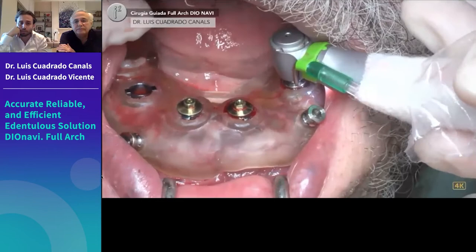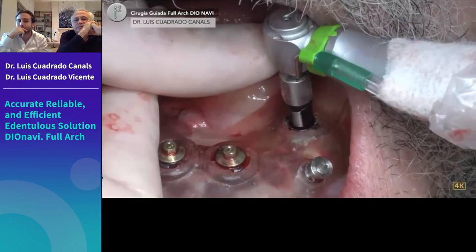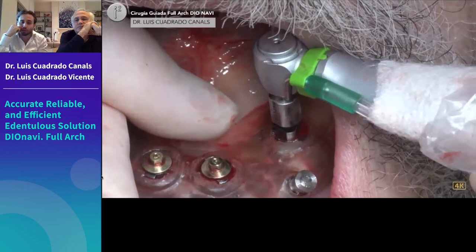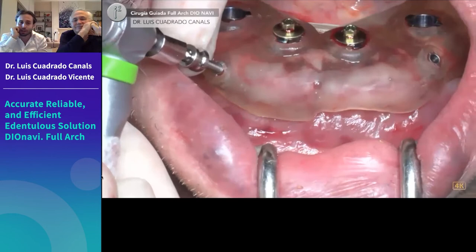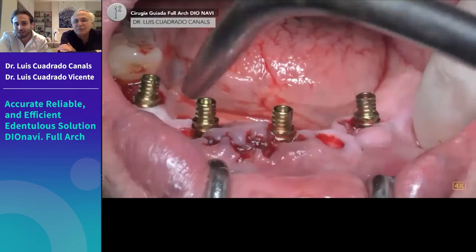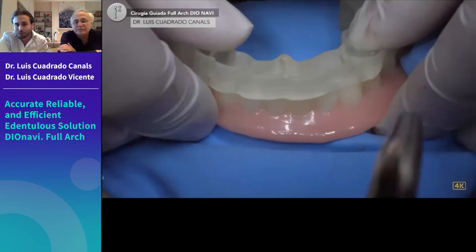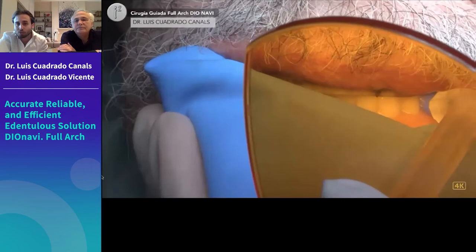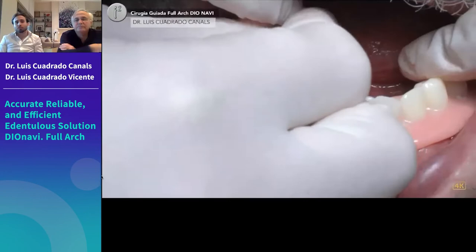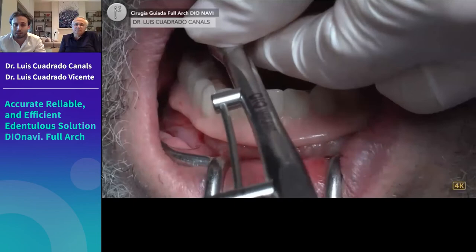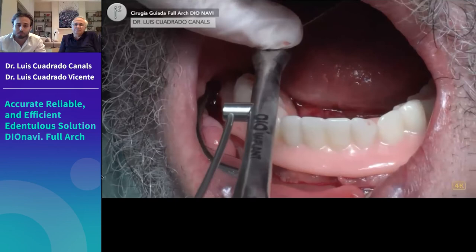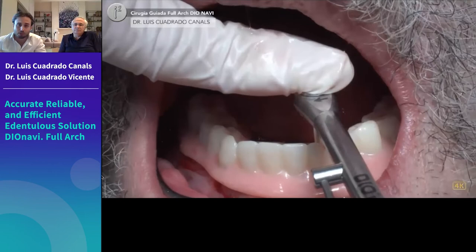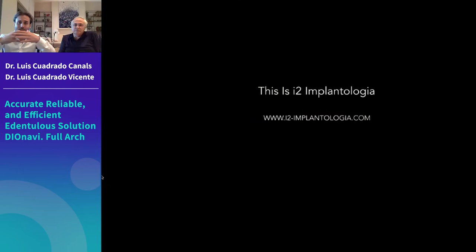Torque recommendations: place multi-unit abutments at 30–35 Ncm and provisional screws at 25 Ncm for correct fixation. This completes the lower arch case. Moving to the second case — a bimaxillary case — we first treated the upper arch. The pre-op photos showed a large bone defect in the upper incisors, so that area could not be used for implant placement without GBR, which the patient declined.